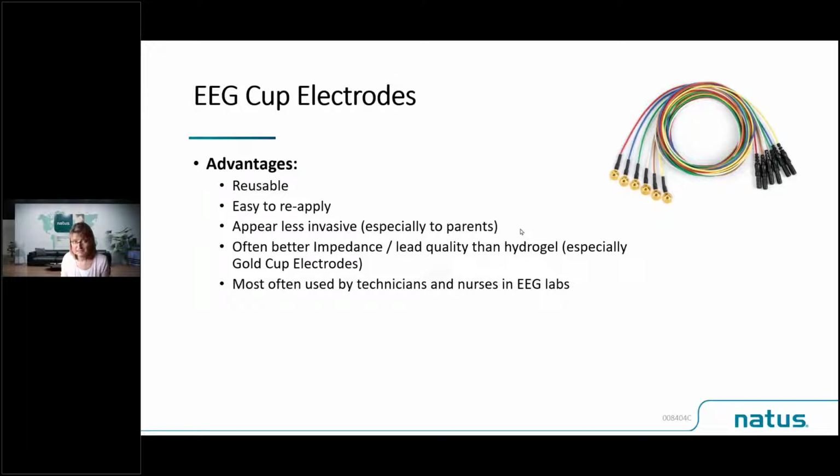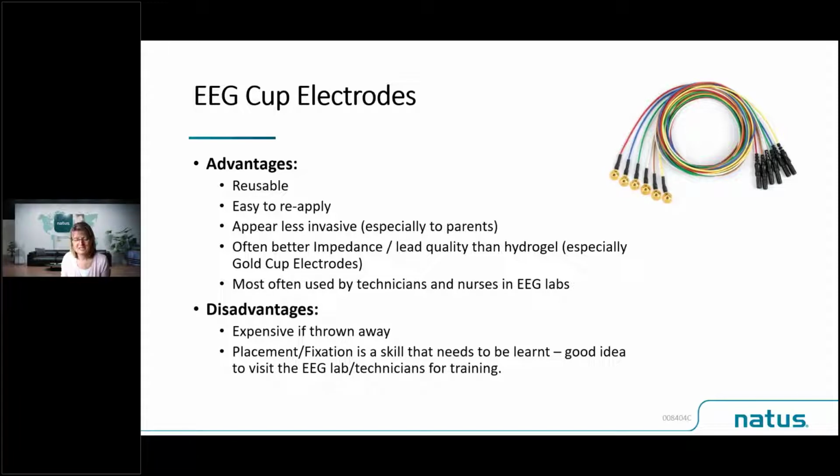But the disadvantages, first of all, they clearly are more expensive because they're reusable. So if they're thrown away, then that can become an expense. We actually have ours labelled with a label on each electrode that says non-disposable, so that people remember not to throw them away.